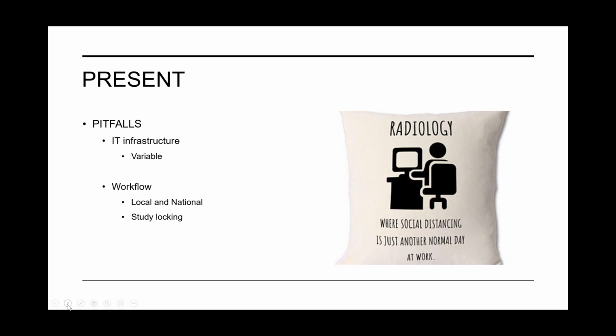And one point that we certainly learned was about study locking. If a study is donated to the national system, that becomes locked in the local system. And if the patient happens to be admitted as an emergency and you want to report that CT that was done as an outpatient only a few days ago, that could lead to issues. Workarounds were very much manual. But with the evolution of workflow management, that is becoming less of a problem, although it still is there in the background.